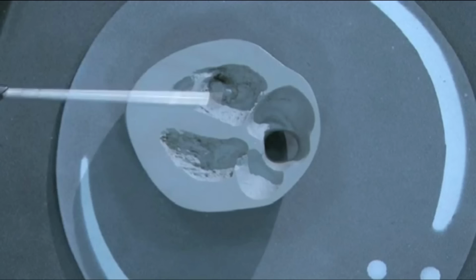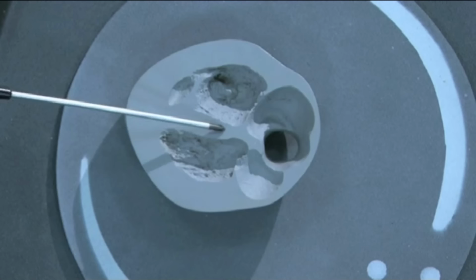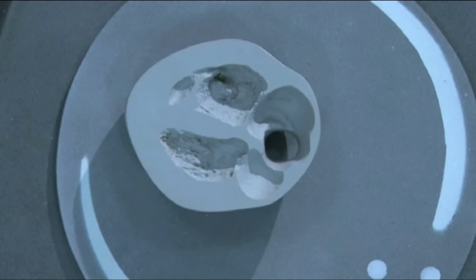Moving on to the four-chamber view itself, there's the right ventricle, the left ventricle, the right atrium, the left atrium, and these should be roughly similar size. The interventricular septum, and the top bit of the interventricular septum called the membranous septum, is often quite thin, particularly when looking down the length of the interventricular septum, and can sometimes be confused for a VSD.